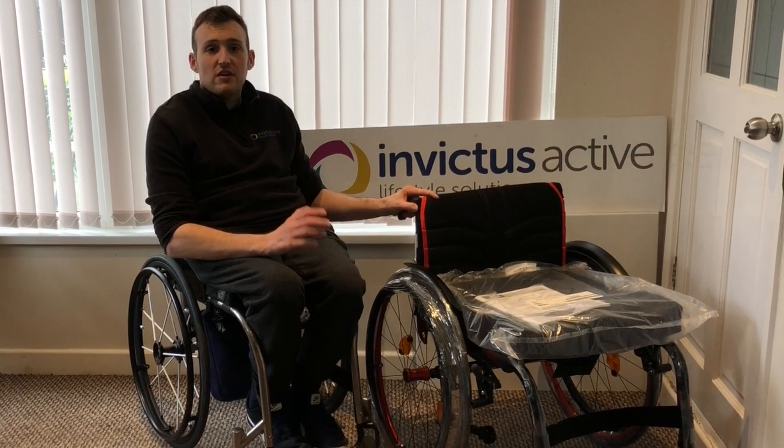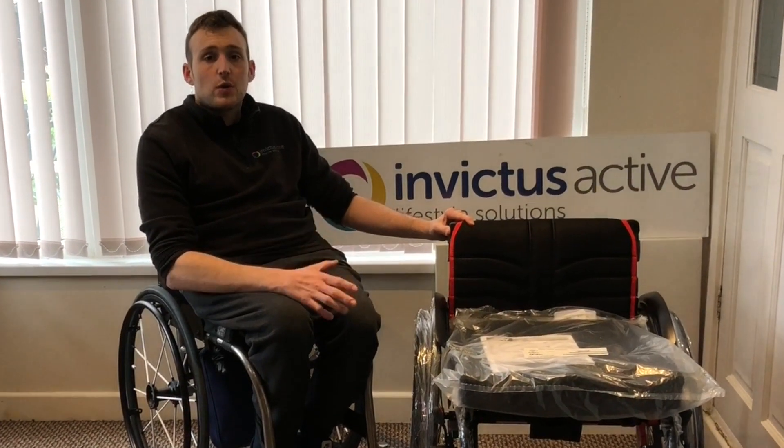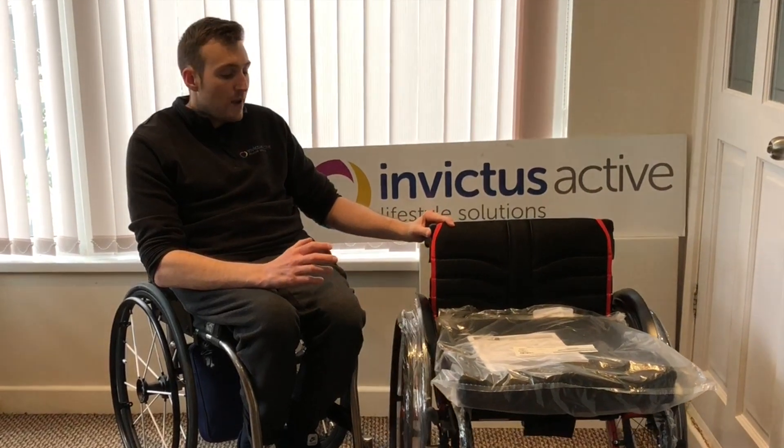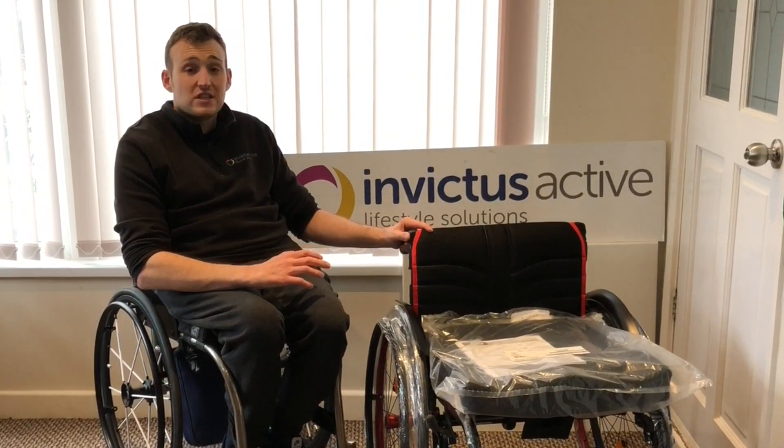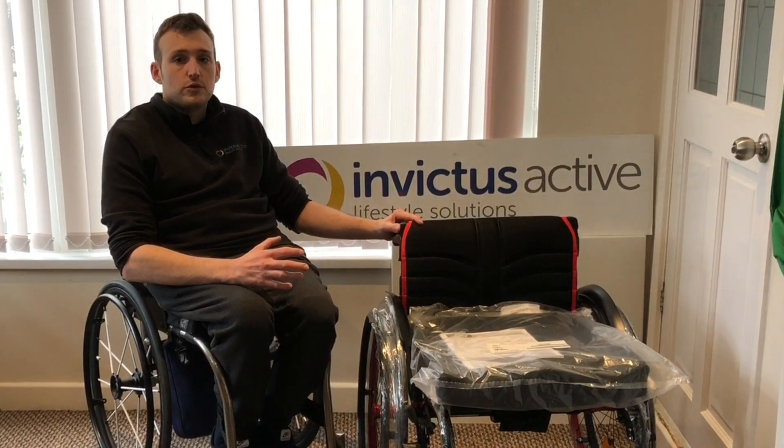Hi, it's Scott from Invictus Active. We can supply a range of active user wheelchairs. What I've got here today is a customer's Quickie Helium. It's got a few extra features on it: the push rims, the caster wheels, the colour sets, and a cushion. I'm just going to quickly run through some of the options.